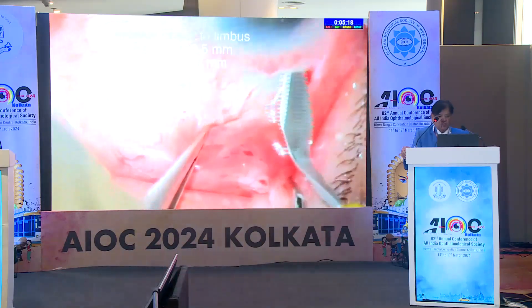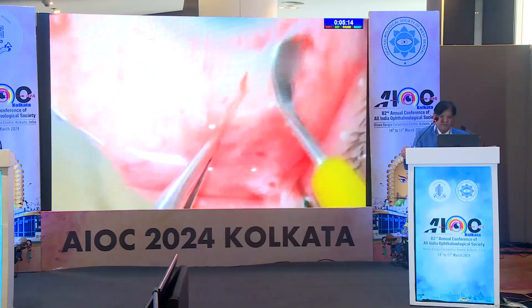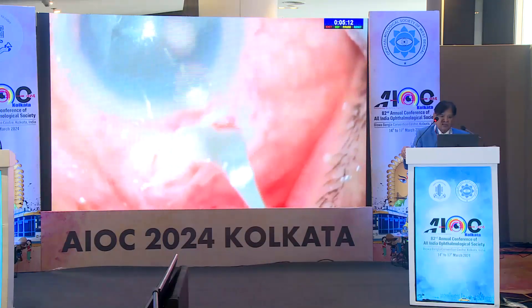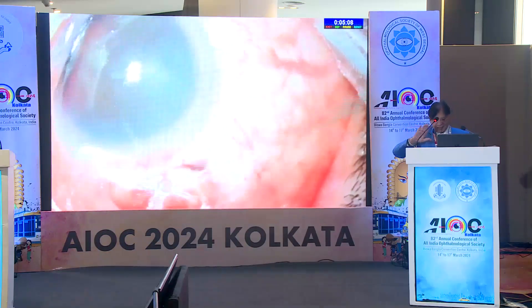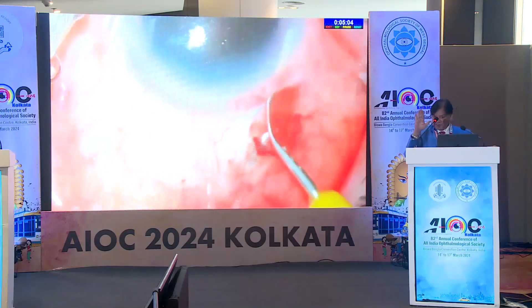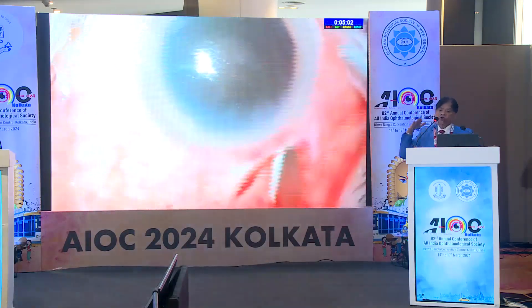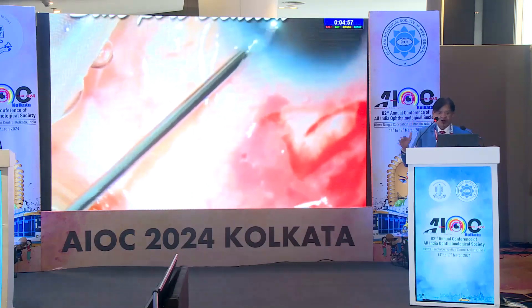You can put back and see the tunnel dissection. Once you make a proper incision, tunnel dissection is another art — you keep your crescent knife, keeping in mind the contour of the cornea. Don't go straight. The cornea curves like this and then like this, so you must follow that contour.